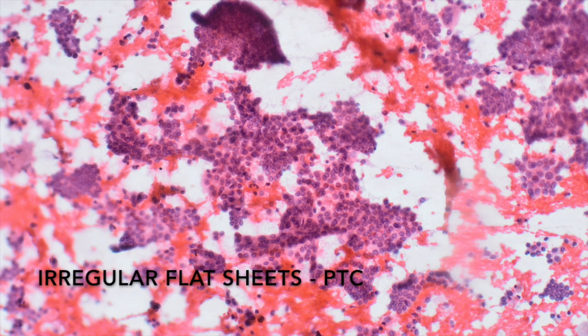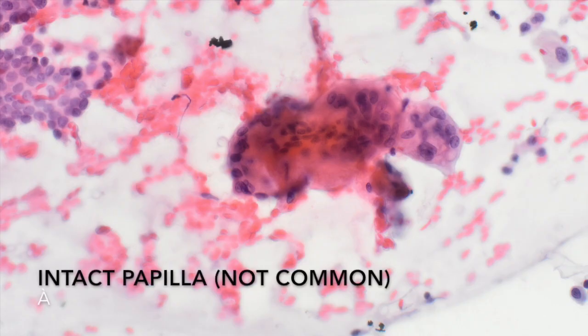In papillary carcinomas, the predominant architecture is irregular sheets with a syncytial appearance, with very few intact papillae, since the epithelium tends to detach easily from the fibrovascular cores.